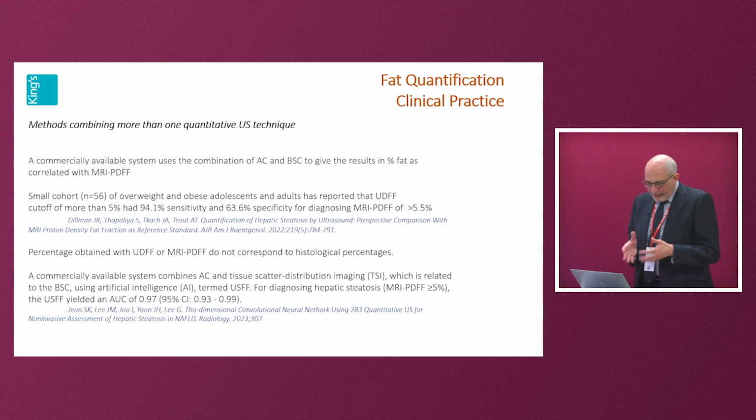So what have we got? Well, we've got one system out there that combines attenuation and backscatter and gives it as a percentage of fat. This is reasonably accurate compared to MRI PDFF. But the cohorts of patients that they've looked at are small, so you've got to wait on this a little bit longer. But it does give you that ability to relate to the patient and clinician. So I think probably over the next few years we'll see migration to this sort of measurement, with all the background information available to you, but the headline value shown on your machine.